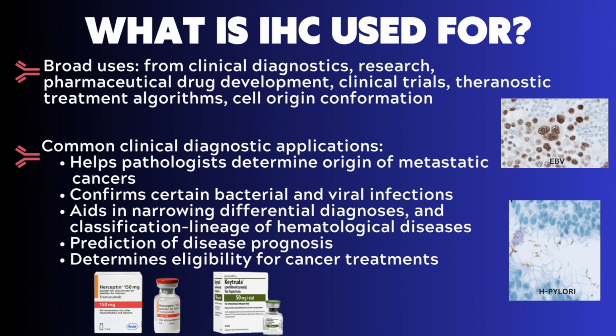Underneath the EBV image, there is another IHC photograph of a stomach biopsy. This magnified area shows a diffusely infected stomach lining with Helicobacter pylori, aka H. pylori. This infection can lead to stomach ulcers, and if left untreated, can also cause gastric cancer. So you can see the importance and application of IHC to help accurately diagnose patients.